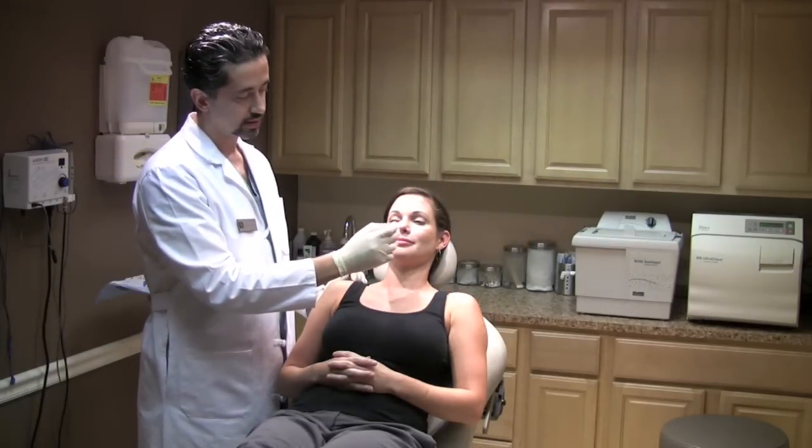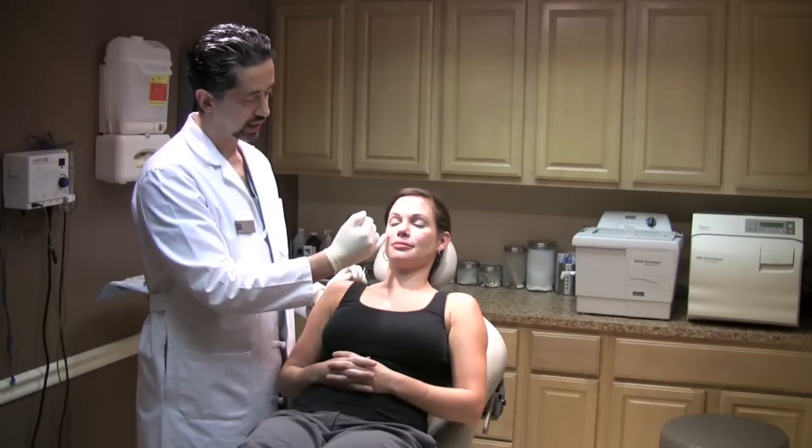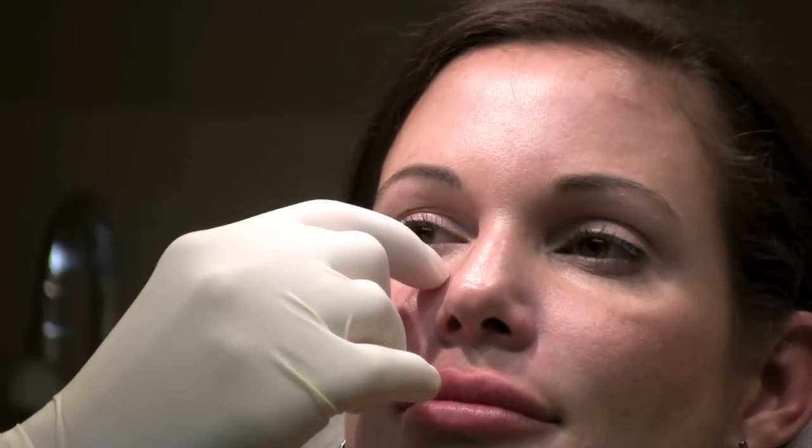So we've done the injection to the lips as well as the nasolabial folds, the smile lines. What we're going to do next is injection of the malar area. The different zones here, as we talked before, are the tear troughs. You can see some patients have a little shadow or a dark circle around the eyes. It can be medially, it can be laterally, or all the way across.